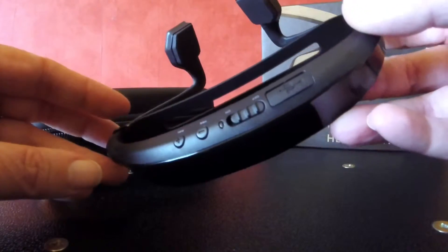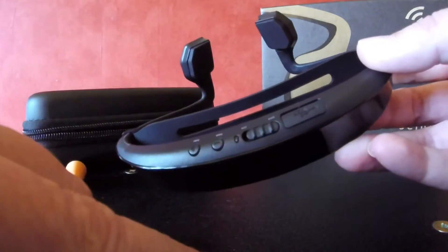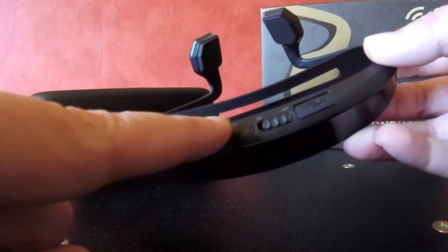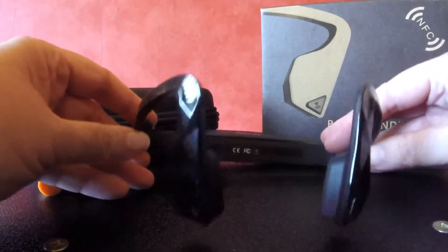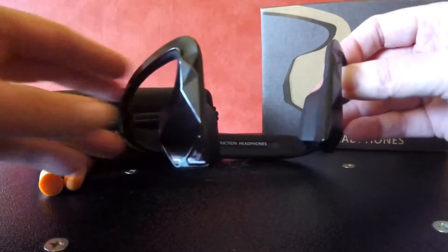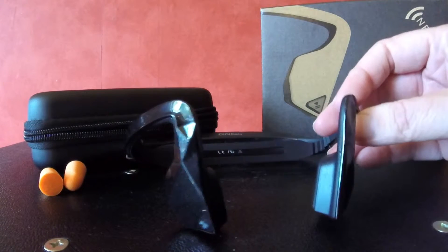The controls on here are very simple. You've got your charging port, your on/off slider, and your volume and track changing — minus and plus. On the front, the left one answers your calls and finishes them. The right one pauses and plays music. Simple.